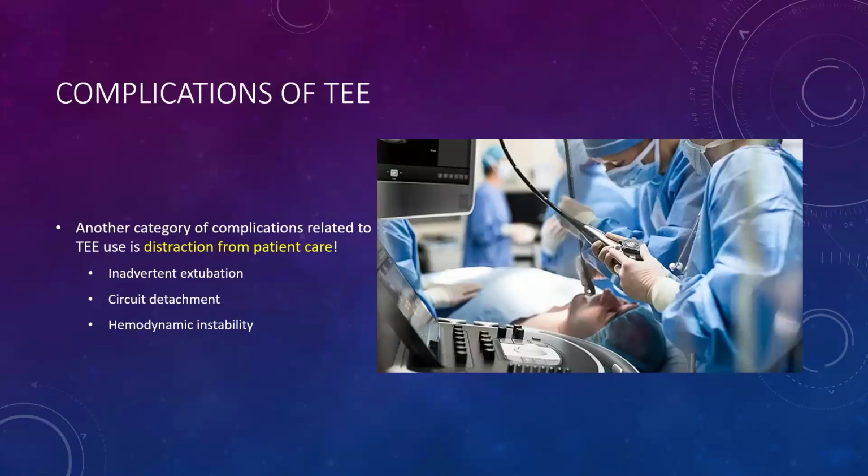The other complication that I think does not get talked about enough, and I think you guys have probably already seen it: when you get a great picture, sometimes people's focus tends to wander towards the picture, right? And they lose sight of everything else that's happening with the patient. This is something that happens in the operating room with my residents certainly quite a bit, because if you've had some TEE pictures, you know that it's even better than a TTE. It is beautiful to look at.